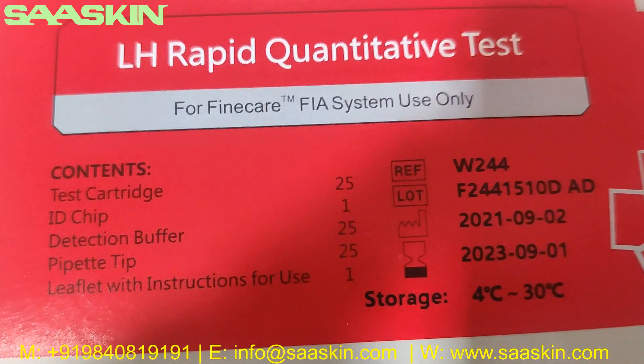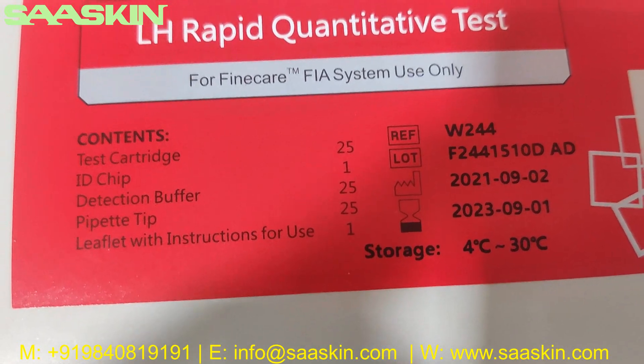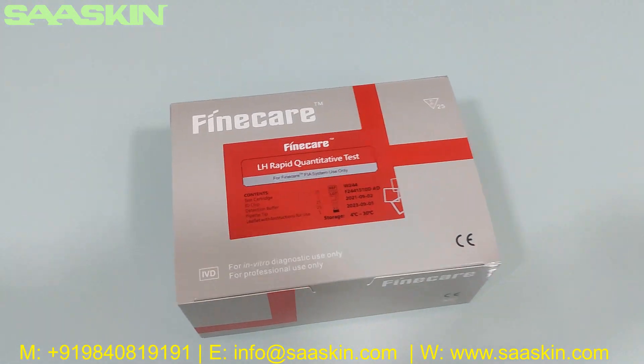The standard contents listed on the box are: 25 test cassettes, 1 ID chip, 25 dilution buffers, 25 pipette tips, and 1 leaflet with instructions for use.